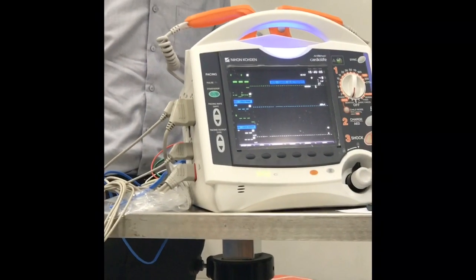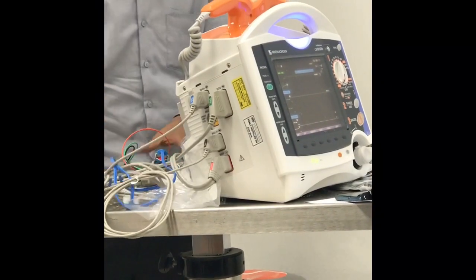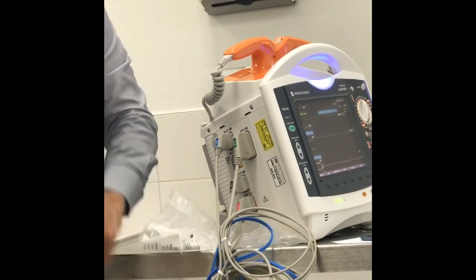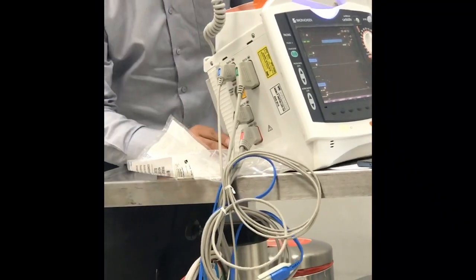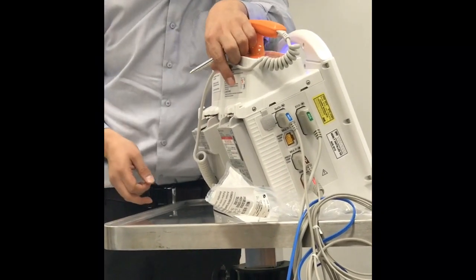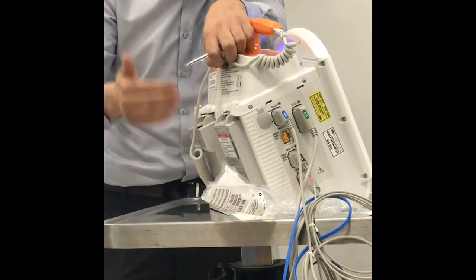Okay, so we have the back side. To know a little technically about the unit, it is good for you. You have the battery and the AC-DC module. This one will charge this one. Okay, you get my point? So this one is the battery, this one is not. It is AC to DC, and this is the battery, okay?